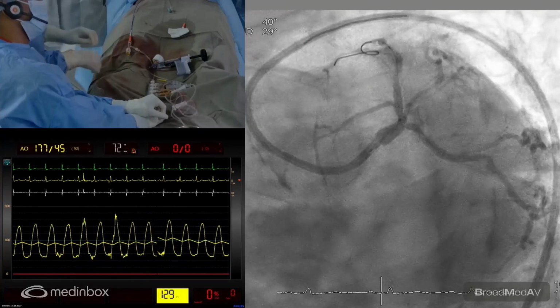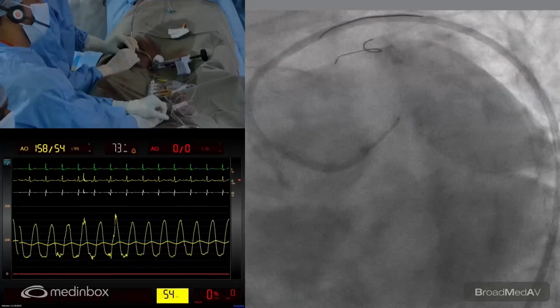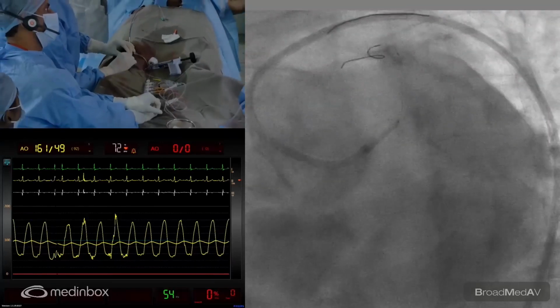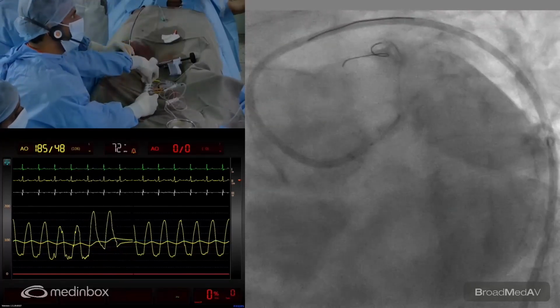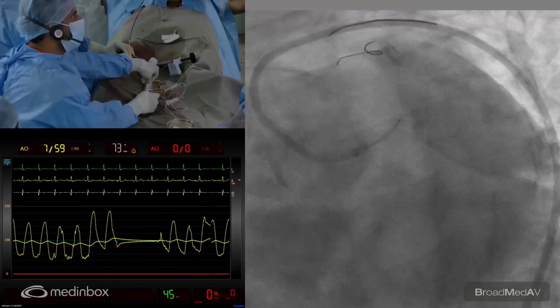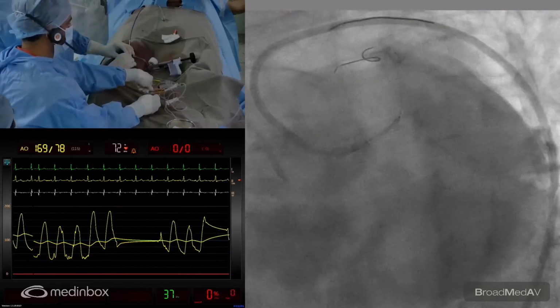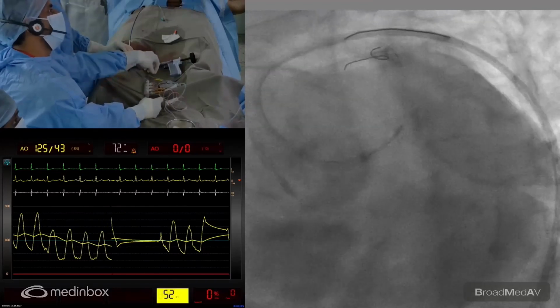We'll have a few millimeters outside here. No, sir, it's okay. I think we'll pull back. I think we should be back a millimeter. Okay, small check, please. Small check. Okay, that seems to be all right, isn't it, Nanda? Yes.